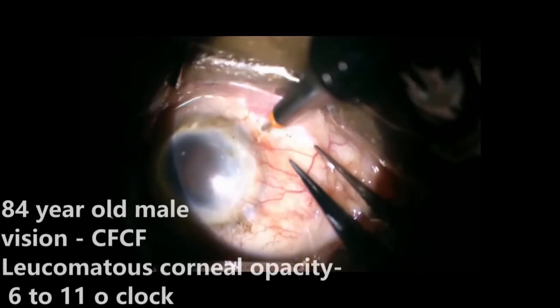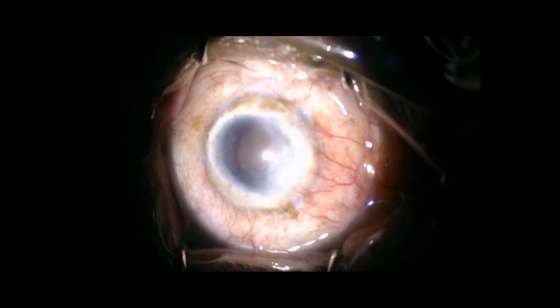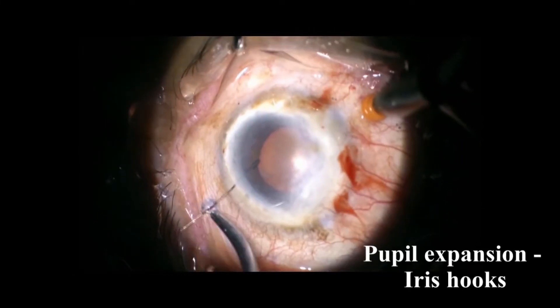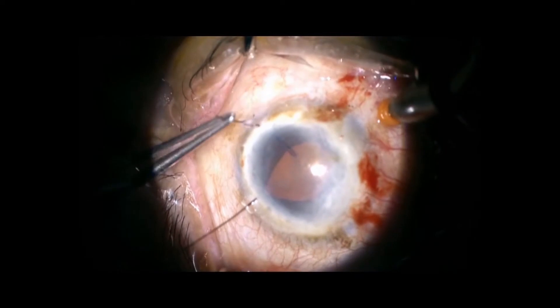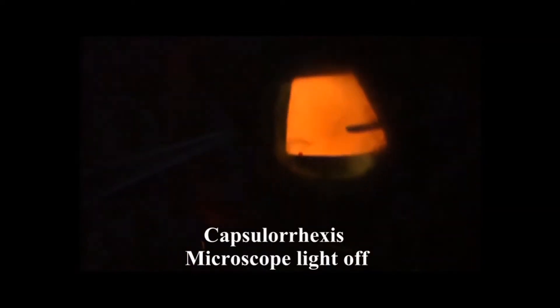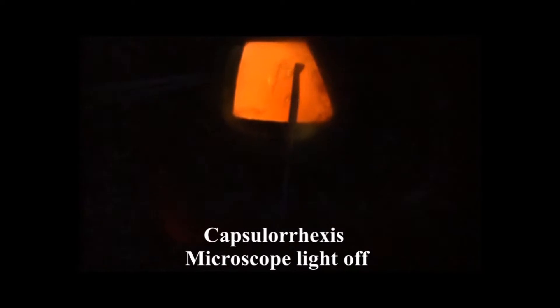The second case had a non-dilating pupil and a poor view. After fixing the chandelier, iris hooks were placed. With the microscope light off and the chandelier light on, capsulorrhexis was completed.